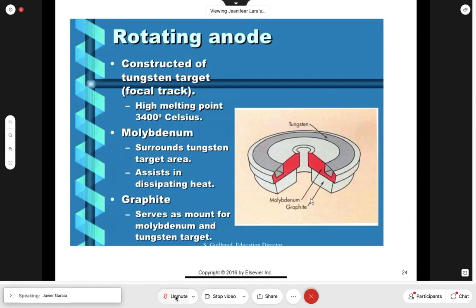Anybody else have questions? We got 5 more minutes. So the stem is molybdenum, and then that runs into the core, which is molybdenum, and then the shaft around that is made of copper with the iron embedded in it. Yes. Okay.